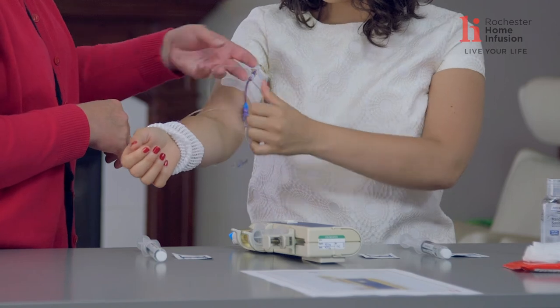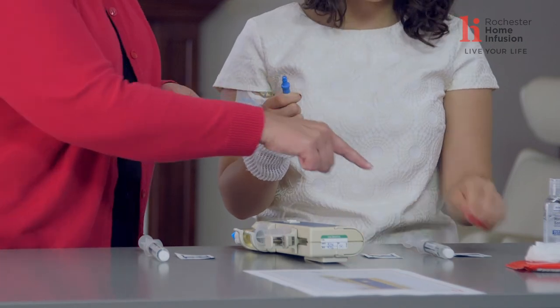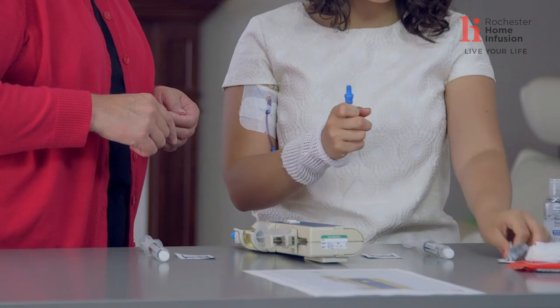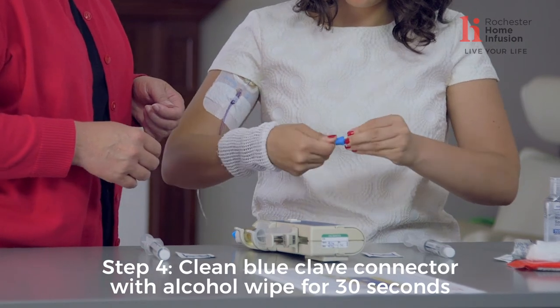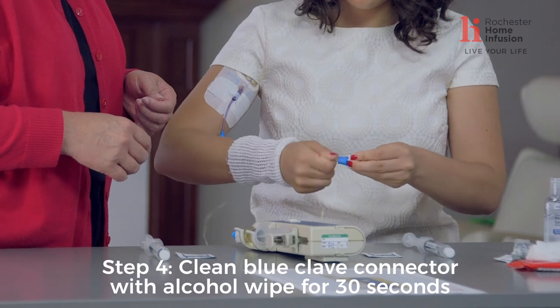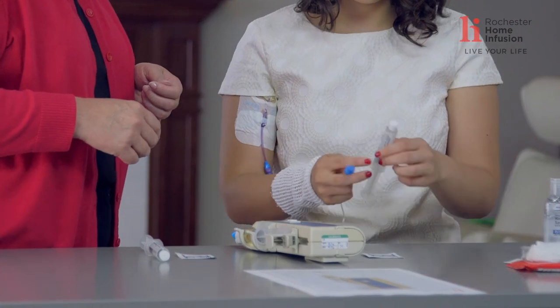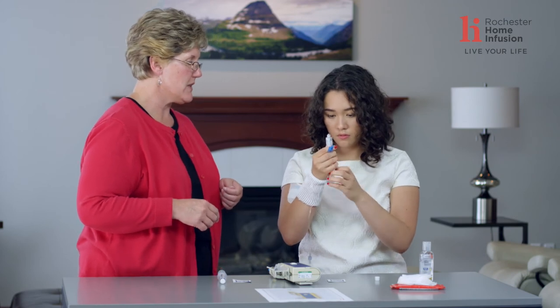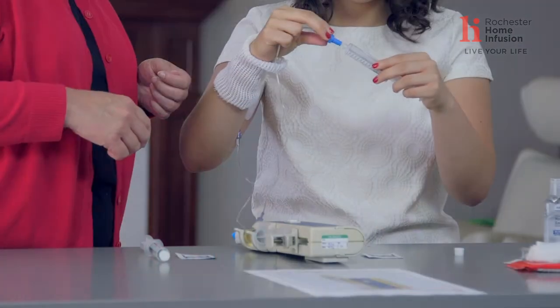Pull down your sleeve, carefully unwind your line until you're holding your clave in your hand. Take your first alcohol wipe, tear it right through the middle, lay the alcohol pad right over the end of your clave, wrap it, and twist and turn for about 30 seconds. As you complete those 30 seconds, take your normal saline syringe, hold it up nice and straight, take the cap off, and remove the air until you see a couple of drops — then you know you're good.